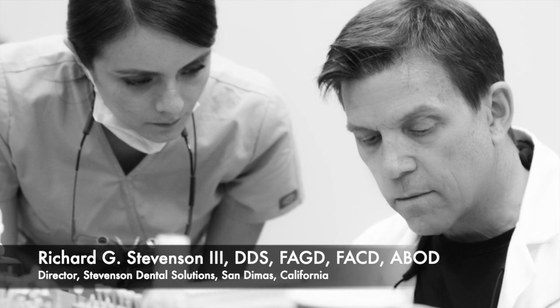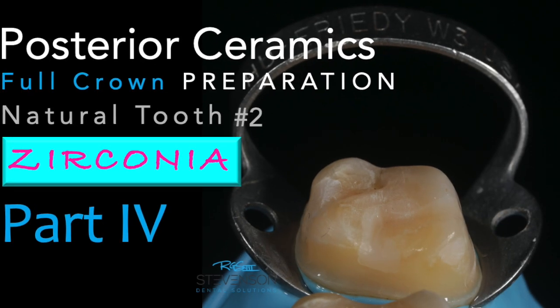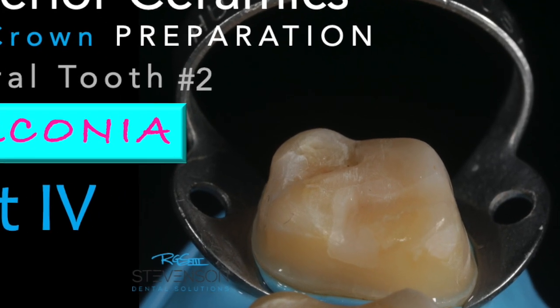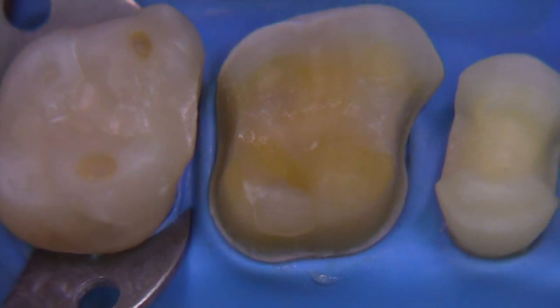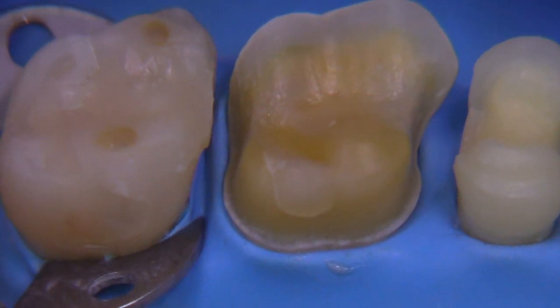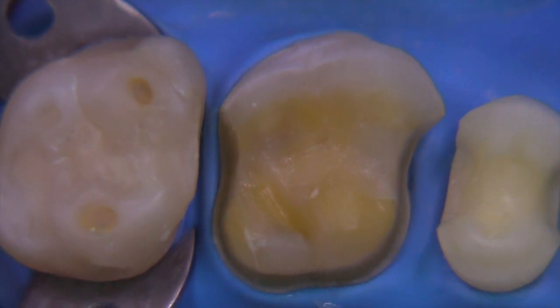Today we're going to tackle the full ceramic crown preparation for zirconia on a natural tooth mounted in the typodont. As you remember from the last video, we did the three-quarter crown and I'm just reviewing that with you just a little bit because this has the same margin design that we're going to be shooting for today.